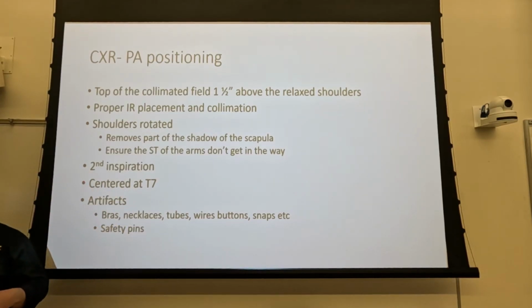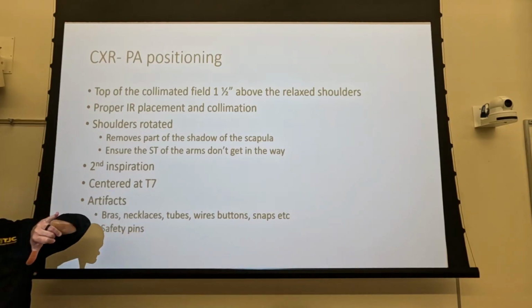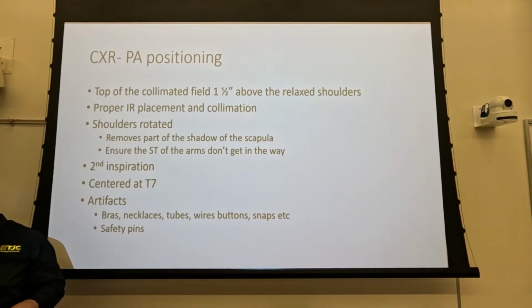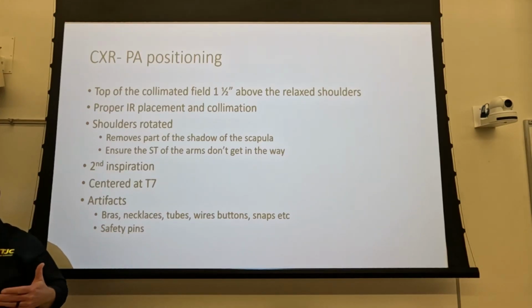What you'll see in other textbooks is that if you put your pinky finger on the vertebral prominence, that's a knot on the back of your neck, and you extend your thumb down the patient's back, that'll get you roughly to T7. Well, the problem with that is that, like my daughter has these hands that stopped growing when she was about 4 months old. I mean, she's got tiny little bitty hands, right? Mine's like this, hers would extend to about here. So not real accurate. It gets you in the general vicinity, but not real accurate.